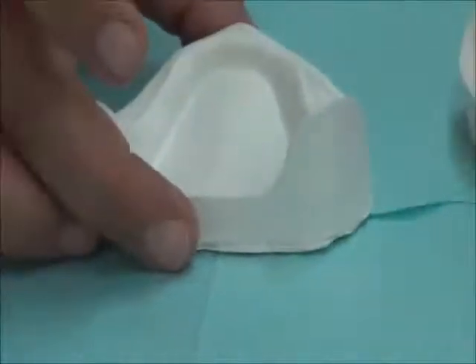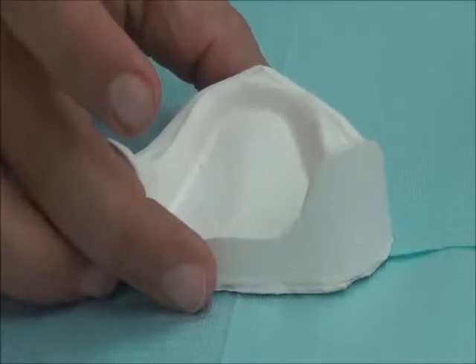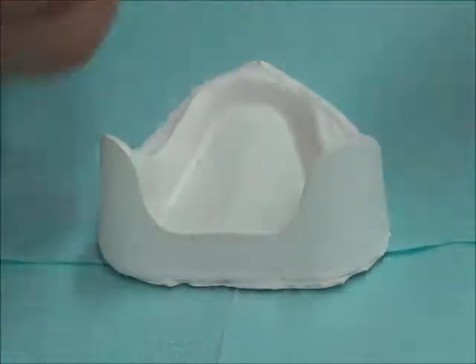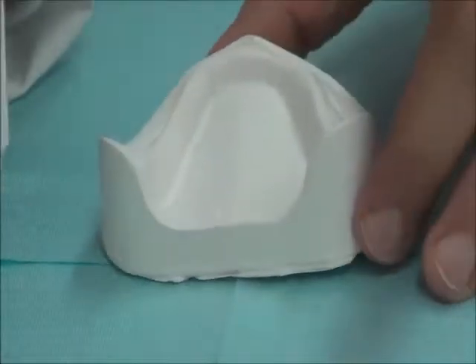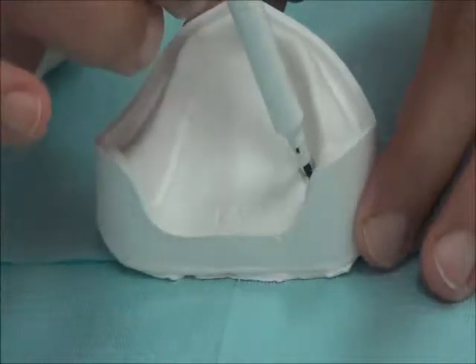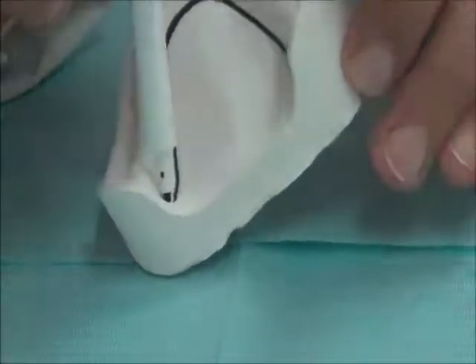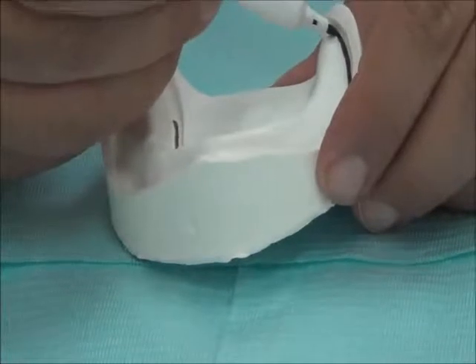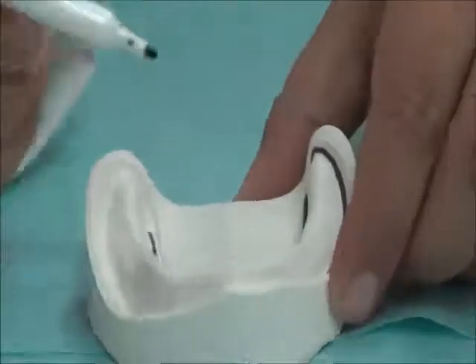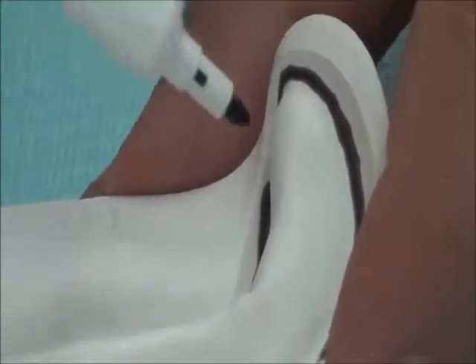For the lower, we are going to follow the perforation method. So for the perforation method, we are going to repeat the drawing of the sulcus. So once more, we put our pen vertically, or pencil if you colored pencil in your case. So just let it run through the deepest areas of the cast. In the posterior area, we should cover inside the tray the whole of the retromolar pad. In the impression, we include it all together. All the retromolar pad is in there.